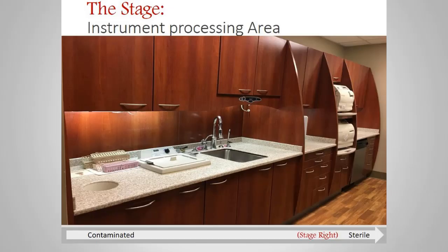Now we go to the stage, and that is our instrument processing area. This slide shows what's meant to be in an ideal instrument processing area for dentistry. The photo is an example of a modern dental sterilization center where the directional flow is built into the design.